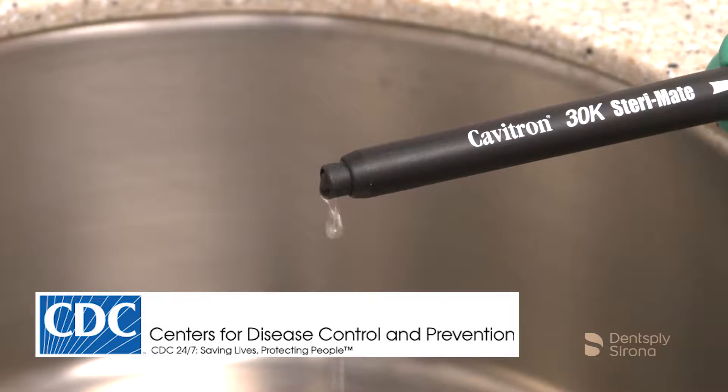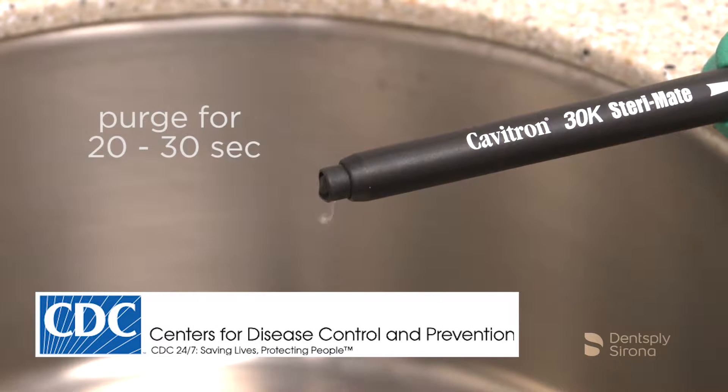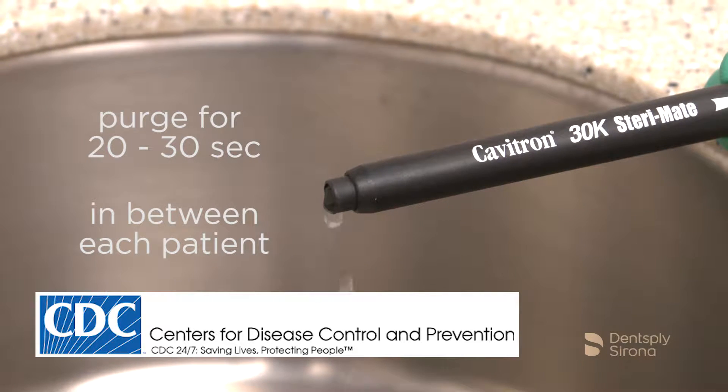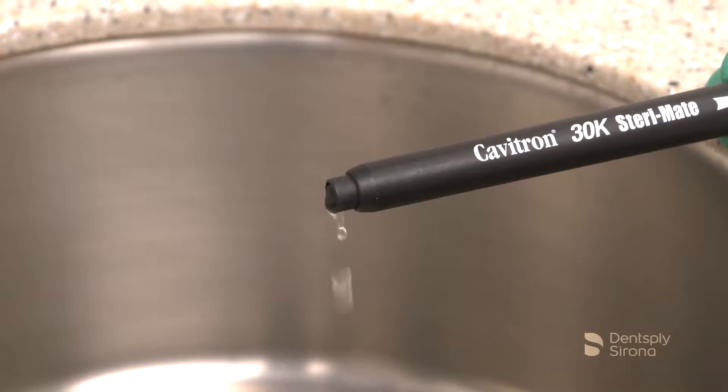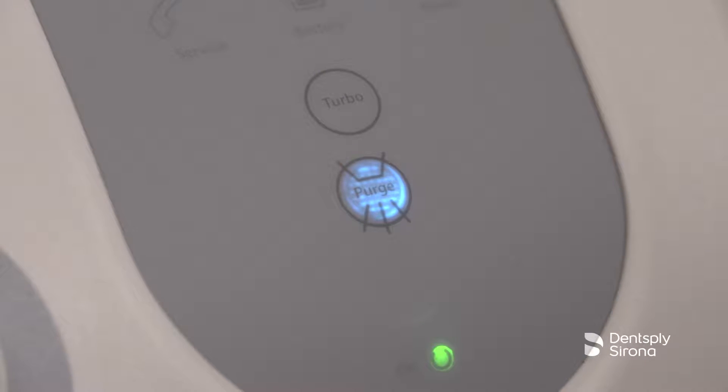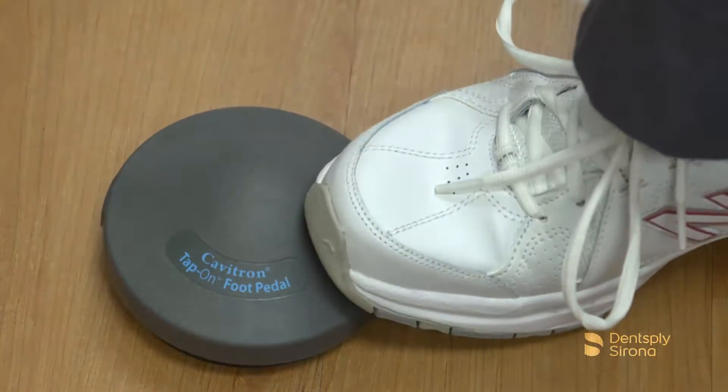Per the CDC recommended guidelines, the handpiece lines should be purged for a total of 20 to 30 seconds in between each patient. This allows any patient material that may have entered the water lines to be flushed out. To interrupt the two-minute purge cycle after 30 seconds, press the purge control button again or simply press the tap-on foot pedal.